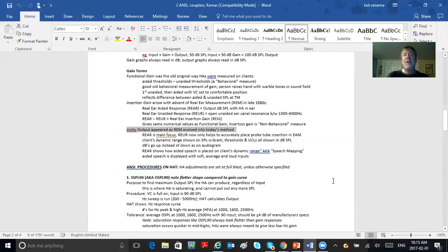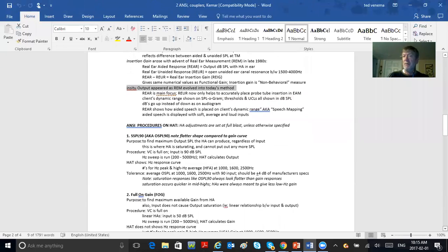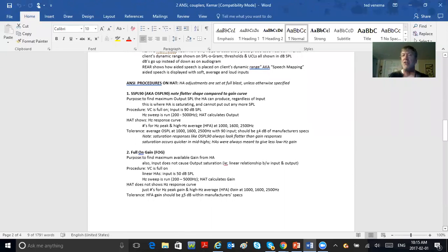We'll just start on these ANSI procedures. I have no thought that we'll get totally done. I really don't, but that's okay. We'll continue on it next time. But take a look. We'll give you an overview. There's five main tests that we need to look at in ANSI. And I'll scroll down to show you.